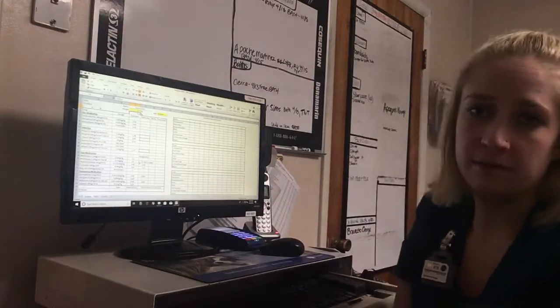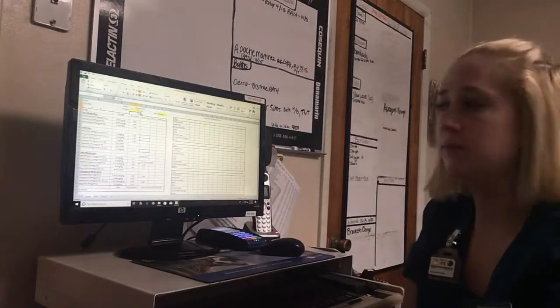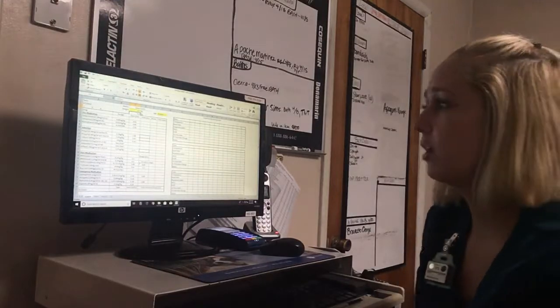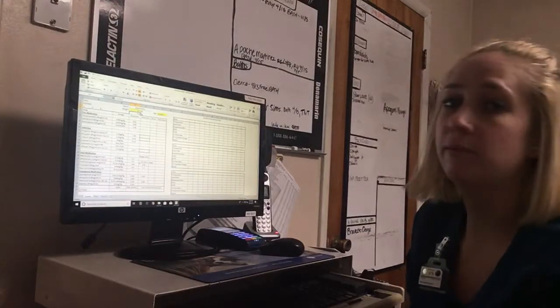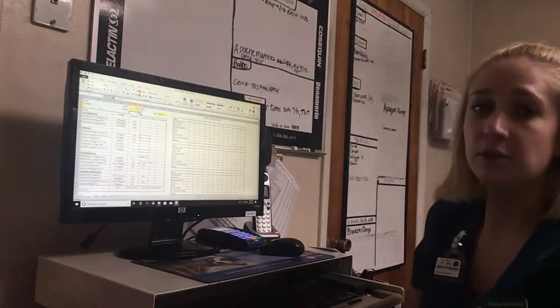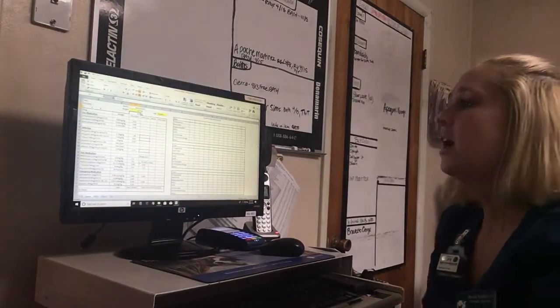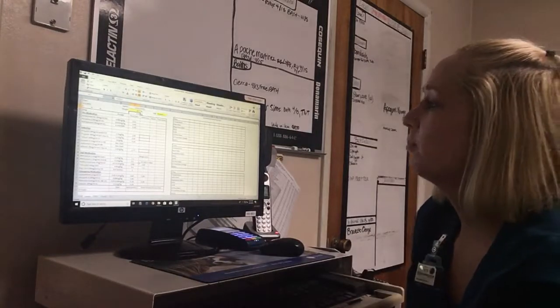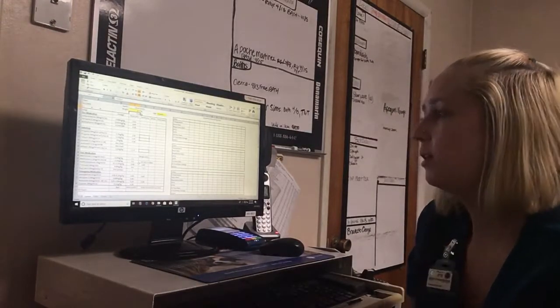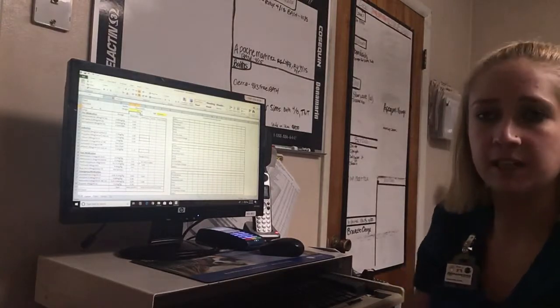So Dr. Turner today has determined that for the pre-medications, he wants to do acepromazine and atropine for our spay, and then for the induction we will be using telazol. So for the acepromazine, we're going to pull up 0.03 milliliters. The atropine, we're going to pull up 0.49. And for our telazol, we're going to pull up 0.24 milliliters.